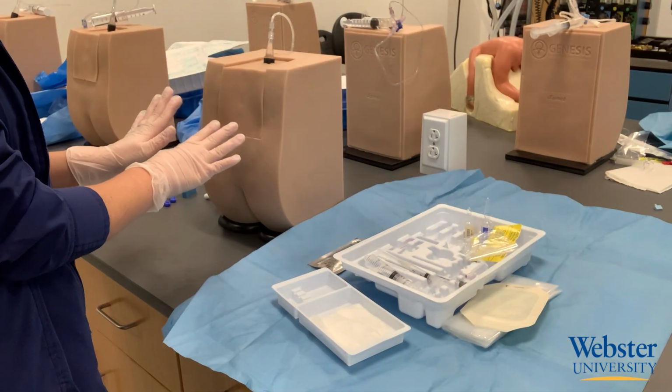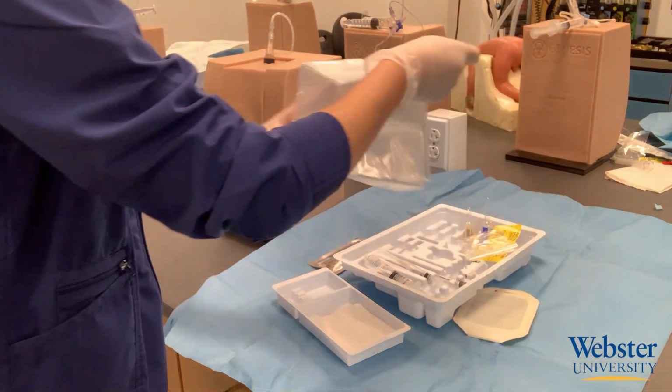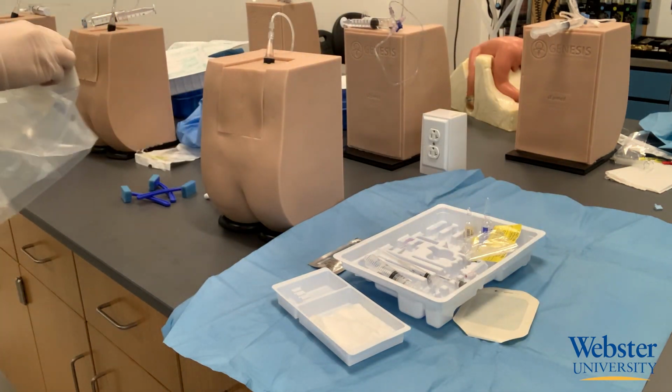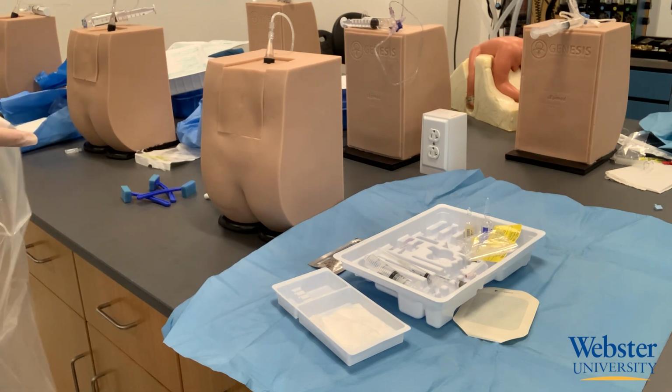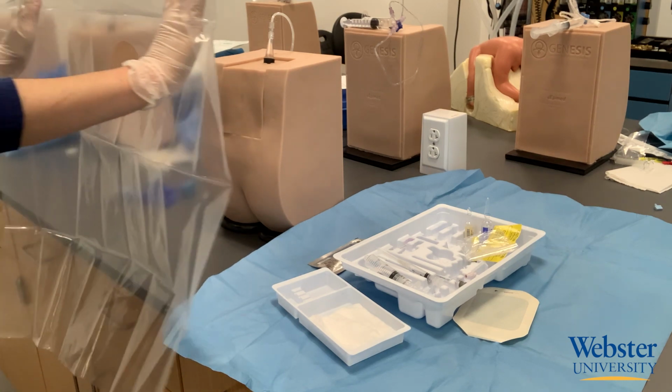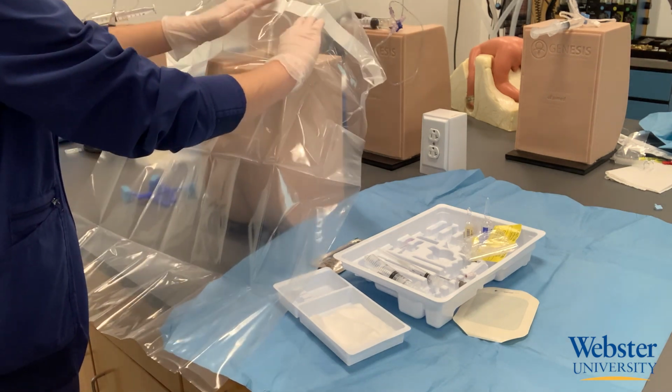After it's been 2 to 3 minutes after the skin has been cleaned with betadine, then you can apply the sterile drape to the skin. You want to make sure the drape stays sterile, so make sure it doesn't hit anything as it's being opened. Line up the desired injection site in the middle of the circle and stick the drape to the patient's back.